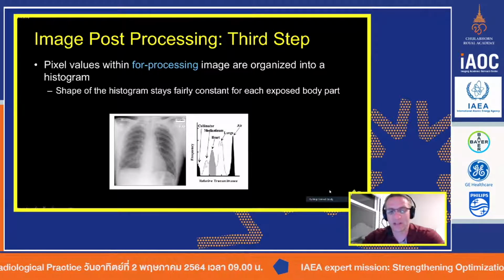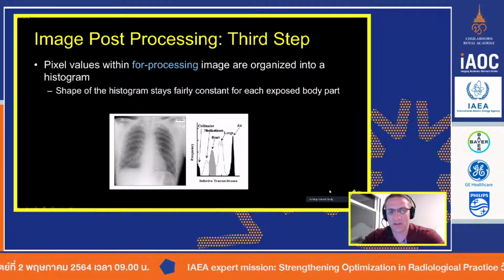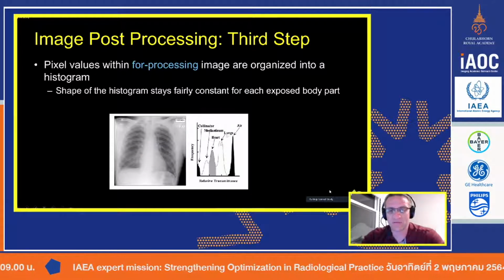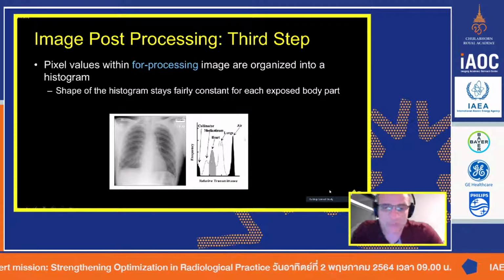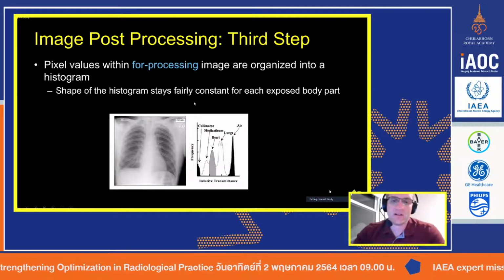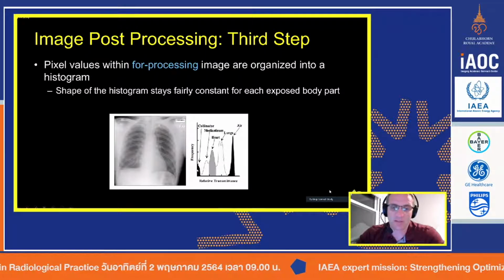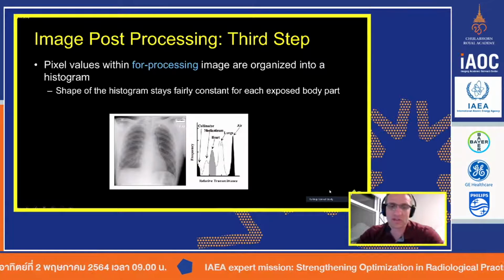And so you can look at this histogram and start to map it to points in the anatomy. This region of the histogram might represent all the pixels in the lung. The middle might be the heart, and then the mediastinum. And of course, the air will be all the way out here. And if there's anything super white, such as bones, or maybe the collimator blade is accidentally in there, it'll be all the way to the left.